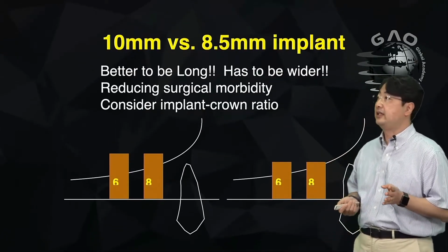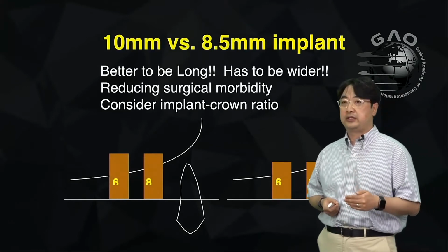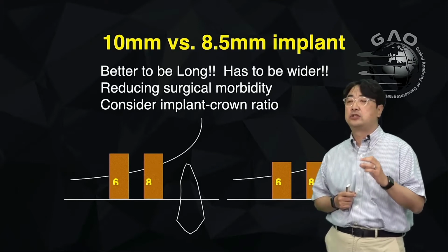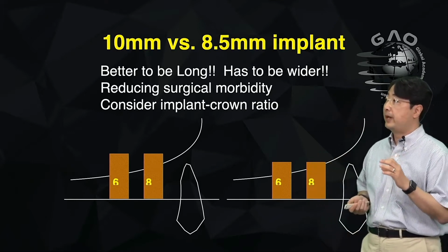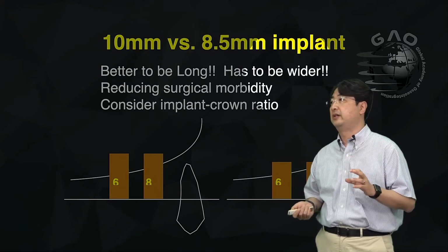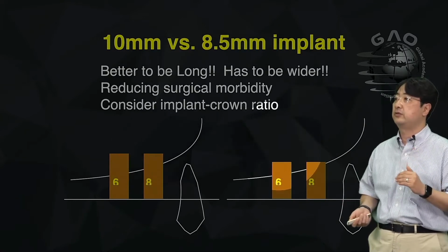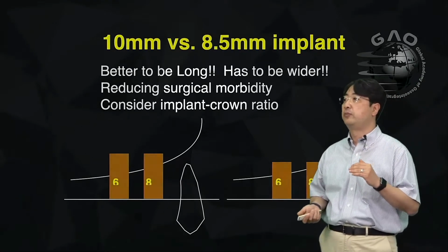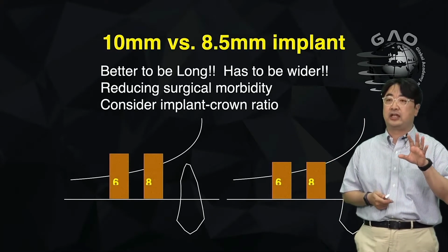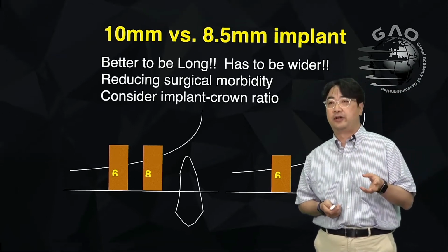When you decide between 10 millimeter or 8.5 millimeter, it depends on the situation, right? You have to think about the crown implant ratio and the space to the antagonist as well. But you have to think about this: better to be long and wider. Also, you can change the treatment plan from the lateral approach to the crestal approach, and maybe you can reduce the surgical morbidity as well. Still, I mention that we have to think about the space that we have, right?